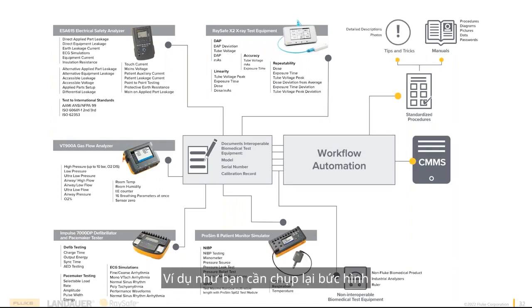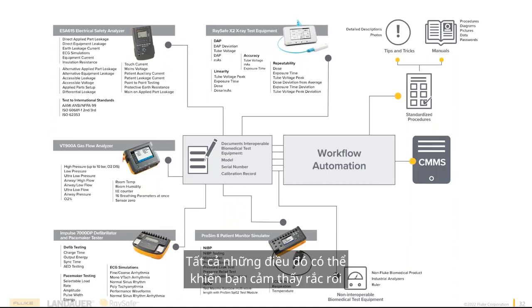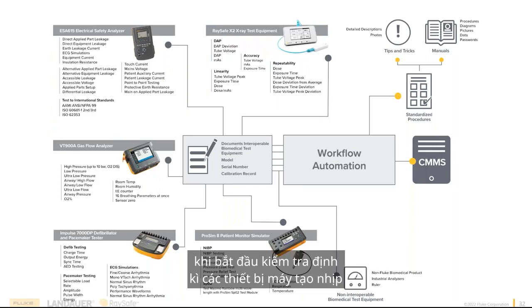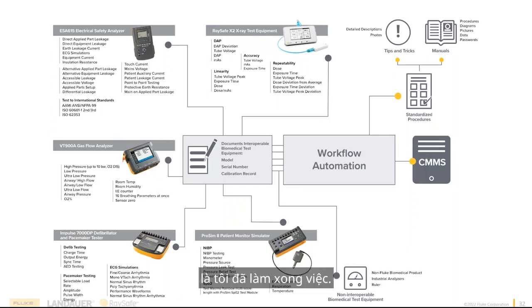Maybe you want to take a picture that you have to take out these 4 screws to get to the filter, or here's the access code, or oh man, you need this adapter and connect it this way. All those things we fret over. I used to get so nervous every time I had to go to transvenous pacemakers. I had like 6 of them. I only serviced them once a year, and I would spend the first 2.5 hours trying to remember how I did it last year. You know how nice it is if I just had a picture to look at and go, oh yeah, I hooked it up just like that, and here's my steps, and click, click, click. Oh, I'm done.